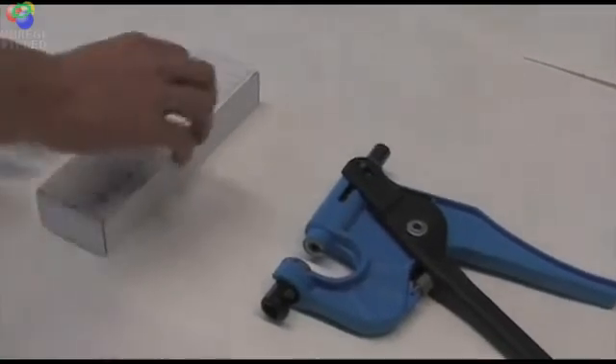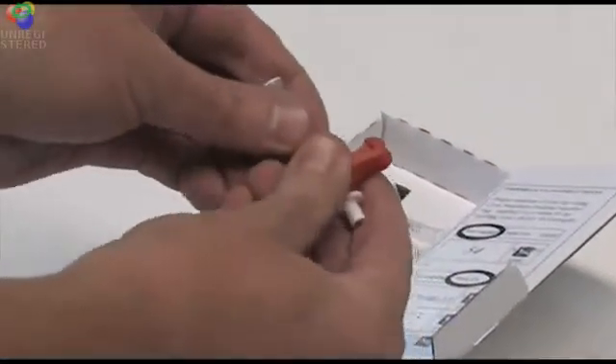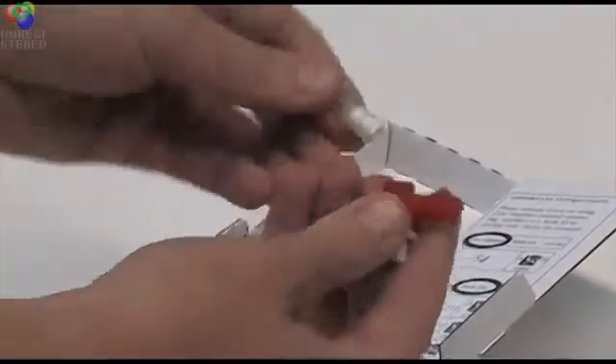Open the box and remove a punch. If a punch is separated into two pieces, you can clip it back together.